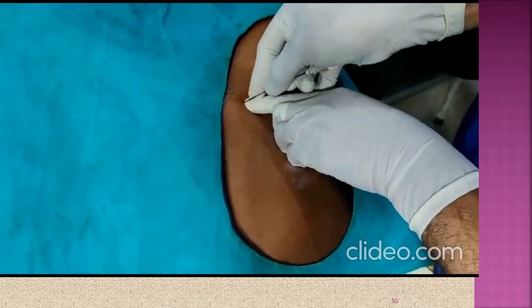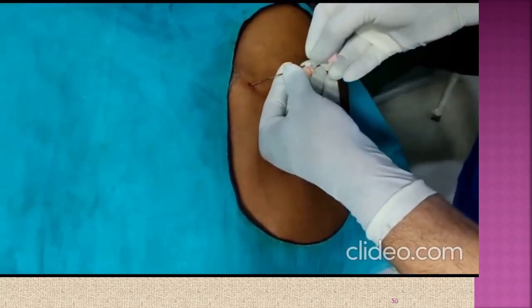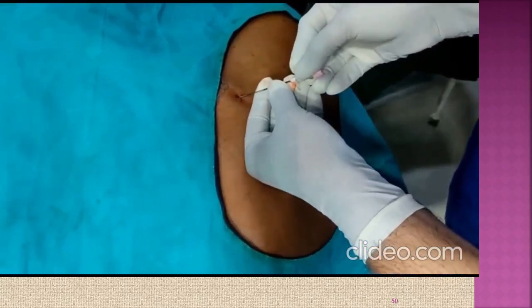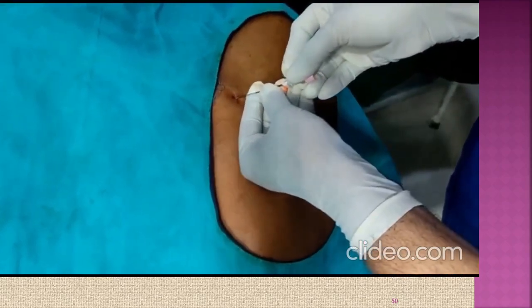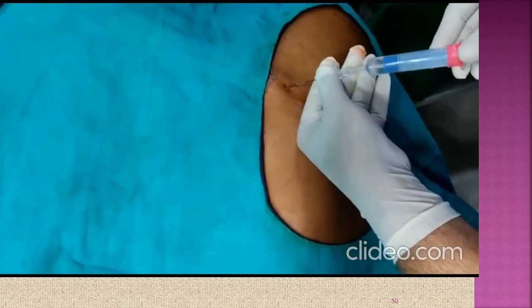Here you can see I am giving epidural anesthesia in the cervical region. The patient is in sitting position. The space selected is C7 T1.